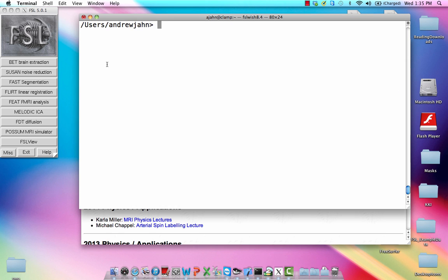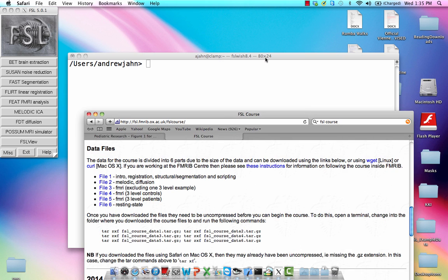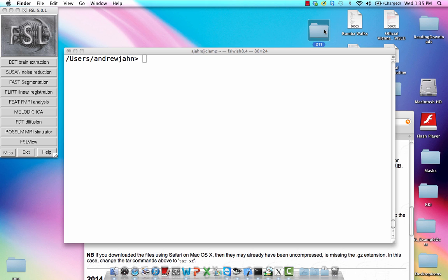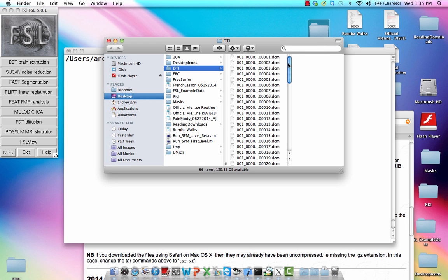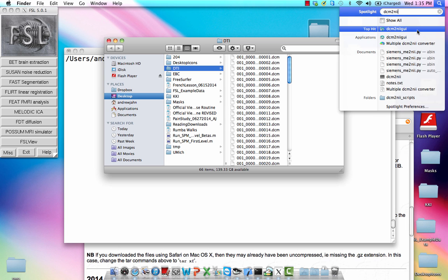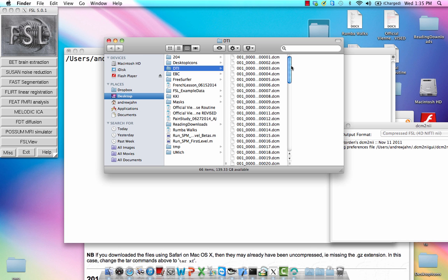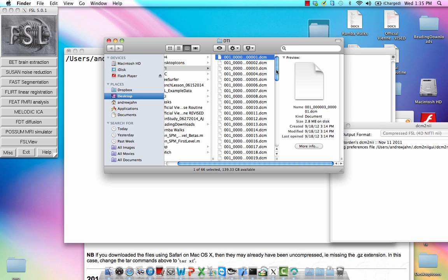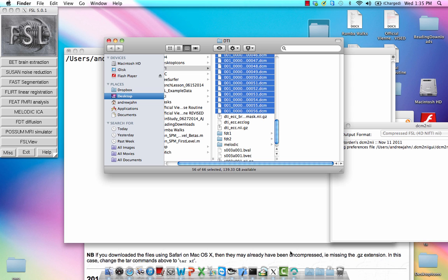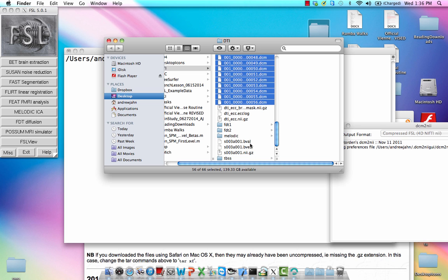If you do have a single DTI dataset, the first thing you want to do is convert it. It's very easy to do this with something like the MRI Cron DICOM to NIfTI tool. If you open up DICOM to NII GUI, you can easily convert DICOM images to NIfTI files by clicking and dragging all your DTI files into this GUI. What you get is a bval file, a bvec file, and the diffusion weighted image. These bval and bvec files help you determine both the direction of diffusion and how much diffusion is going on in a specific voxel or along a specific tract.